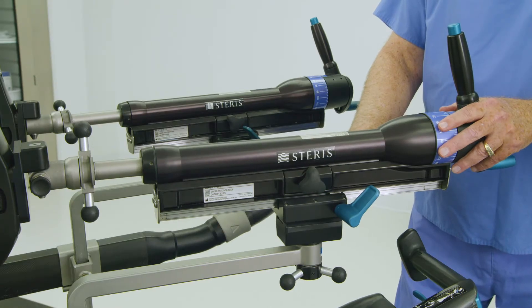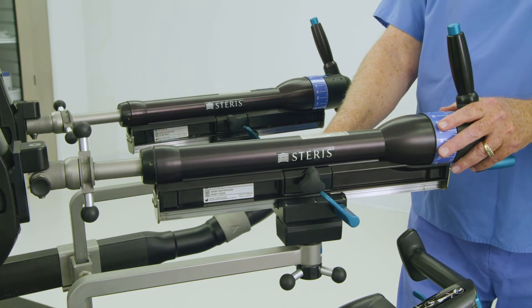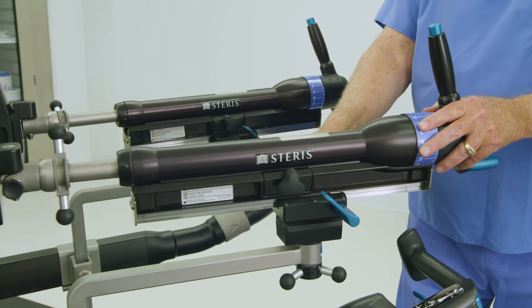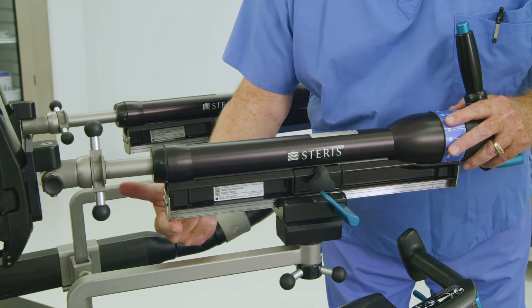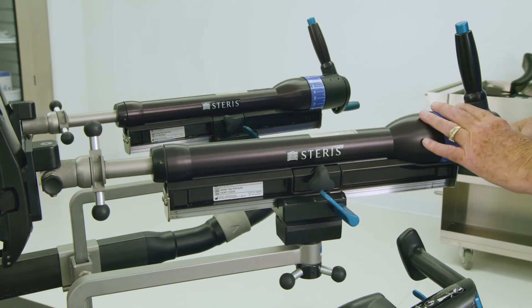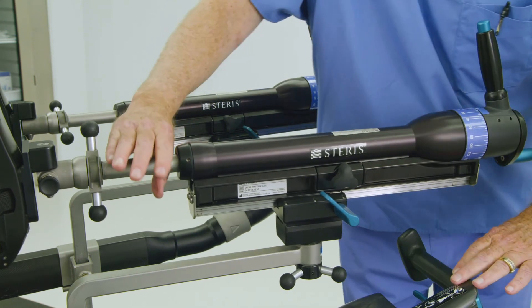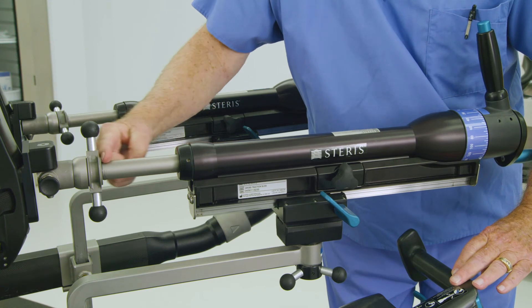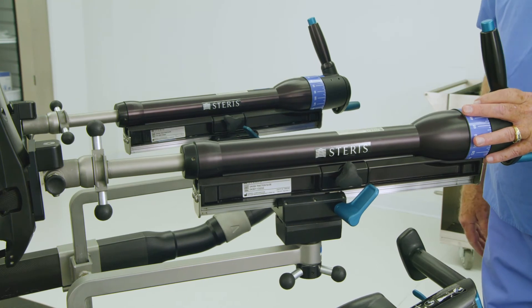Adjusting traction controls prior to pulling traction will help avoid complications. Press the blue paddle lever on the gross traction assembly forward, away from the operator, to release the traction slide. Adjust the gross traction slide to allow 2–3 inches of gross slide at the proximal end of the gross traction unit. Rotate the blue circular handle at the end of the fine traction unit for fine adjustment of the limb foot, allowing 3 inches of additional fine traction adjustment or as clinically necessary. Pull the paddle lever back toward the operator to lock. Always release the gross traction on a patient's leg prior to lowering the spar below horizontal to avoid potential injury.